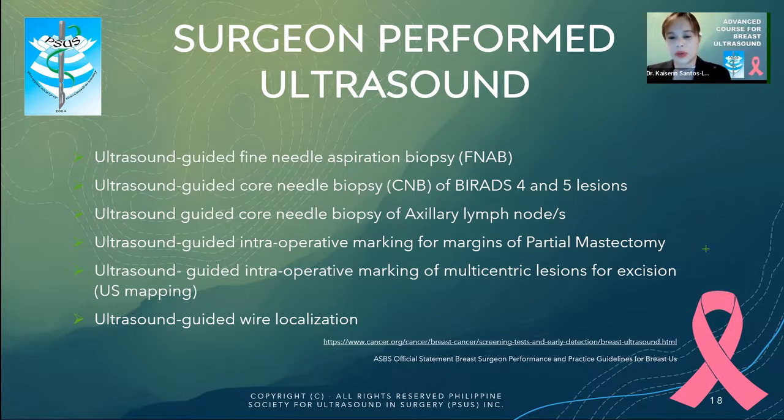Our surgeon-performed ultrasound at the point of care aids us so that we have better visualization, we are more accurate, we are more efficient. We actually decrease our sampling error, we decrease the risk of inadvertent injury, and we also decrease the tissue volume we excise, and we have better margin status.